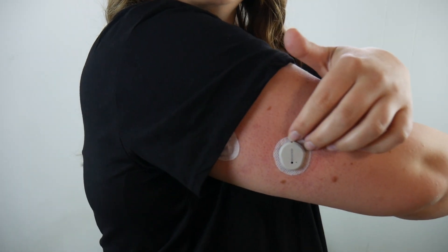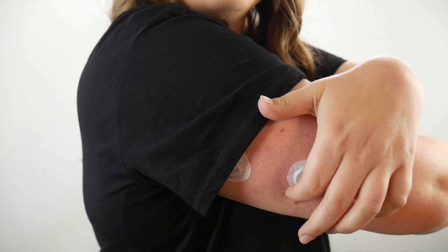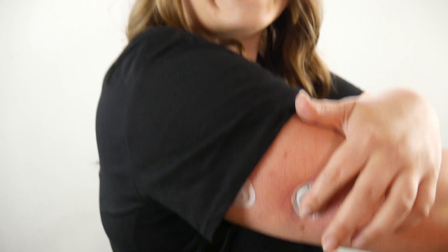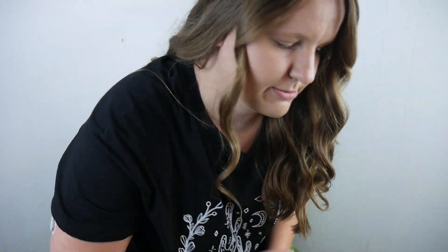My first Dexcom G7! They also recommend you go around the tape — I think it's five times or something like that — make sure it's stuck down really good, and hold the center. Make sure it's stuck down really good, I think it's like 10 to 15 seconds or something like that. And there you have it. It does come with an overtape as well, so let me grab that.